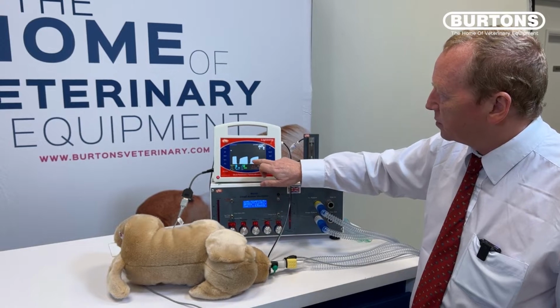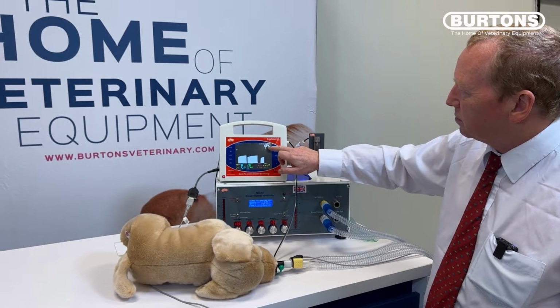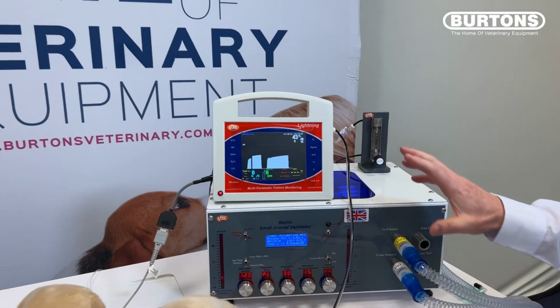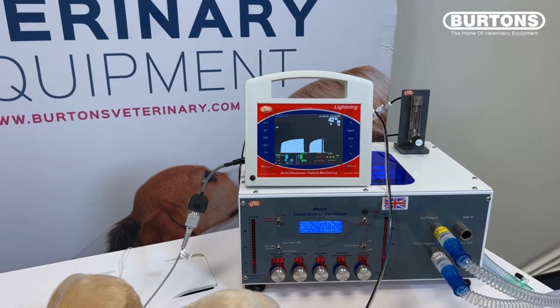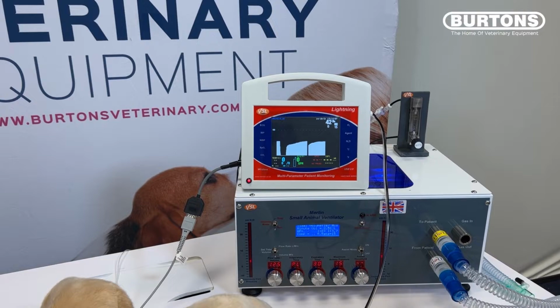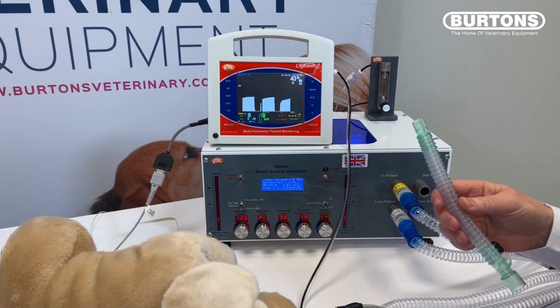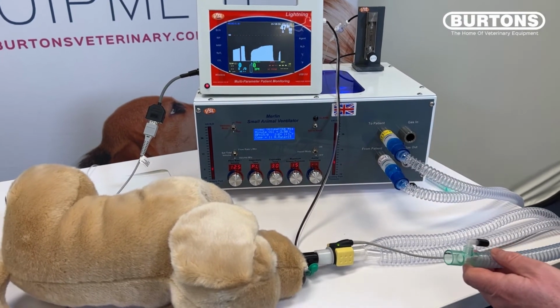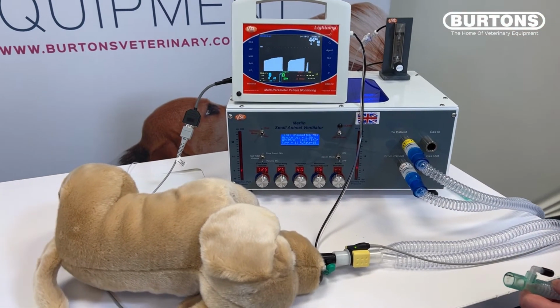We've got a very nice, respectable CO2 trace and an expired end tidal CO2 of 43 millimeters of mercury and an inspired of 0. So this is a typical setup for an animal in surgery or anesthesia. And at this point, we'd be very happy about the condition of the patient. What I'm going to do now is add this amount of dead space, which is about 15 to 20 mils, into the circuit between the capnograph and the Y piece and just note the effect on the end tidal values and the outline of the capnogram trace.